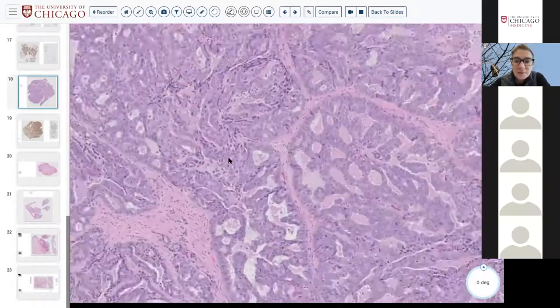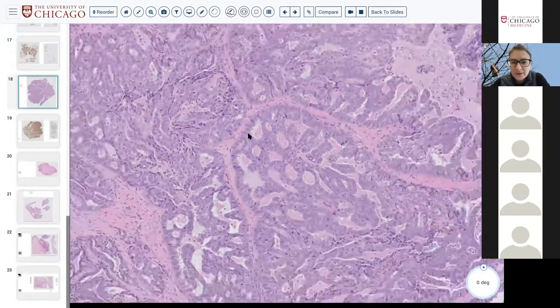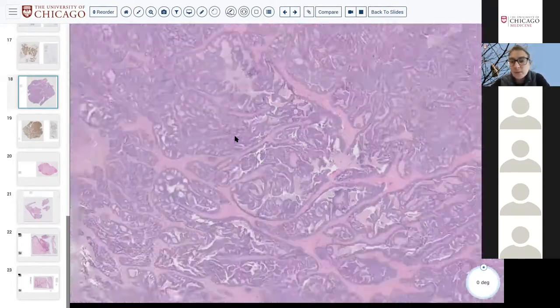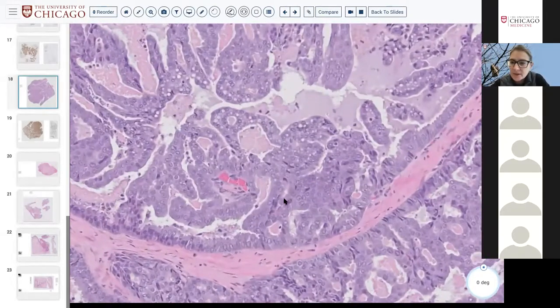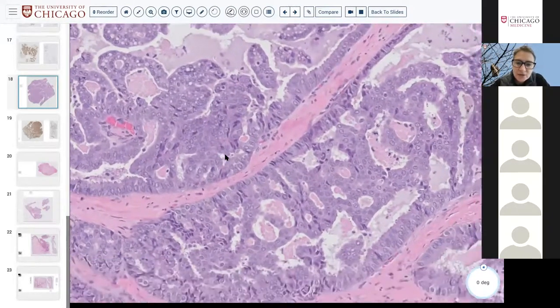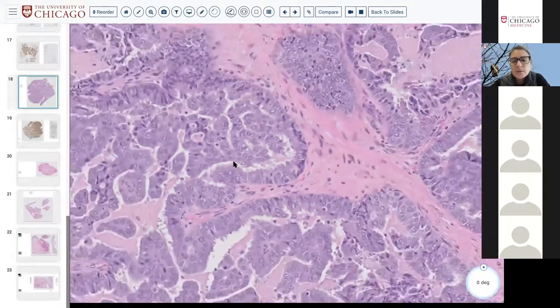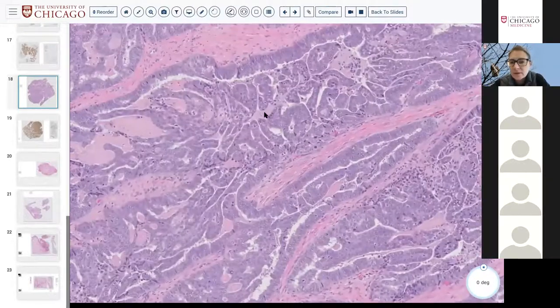Arguably, some might say, does this look like a polymorphous or cribriform adenocarcinoma of salivary gland? Somewhat. I do think that there are some resemblances to that. And that is where genetics might come in handy if you really want to navigate the differences between a salivary type and a non-salivary type sinonasal adenocarcinoma. But essentially, that's what we're dealing with. What is one of the more important parameters that we should give for all glandular type carcinomas of the head and neck?